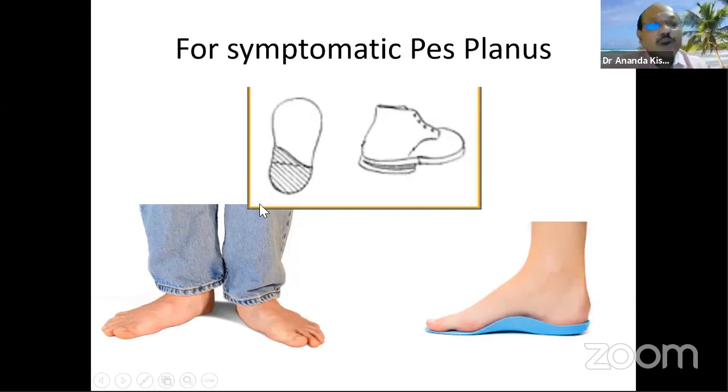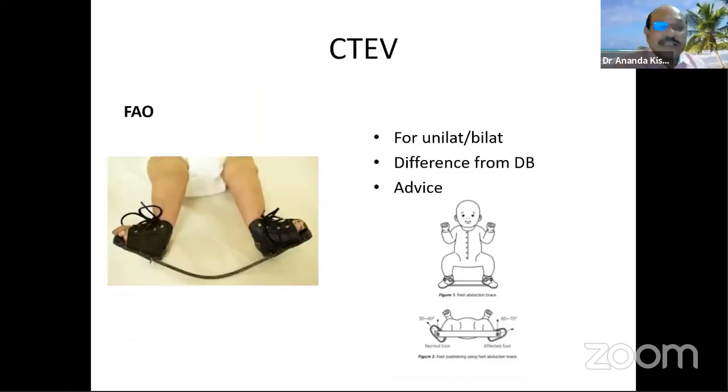So in that case, the medial arch is stiffened enough, and the body will try to develop the medial arch, and that is the basis of the active form of treatment of the flat foot for young patients. For the older patient, that will not help in active development, but that will help in the support of the medial arch. That is a passive one. But the active treatment for this is known as the Thomas extended and crooked heel. The heel breast is extended up to the base or the head of the first metatarsal to stiffen the medial arch, so that the body will try to develop this medial arch.